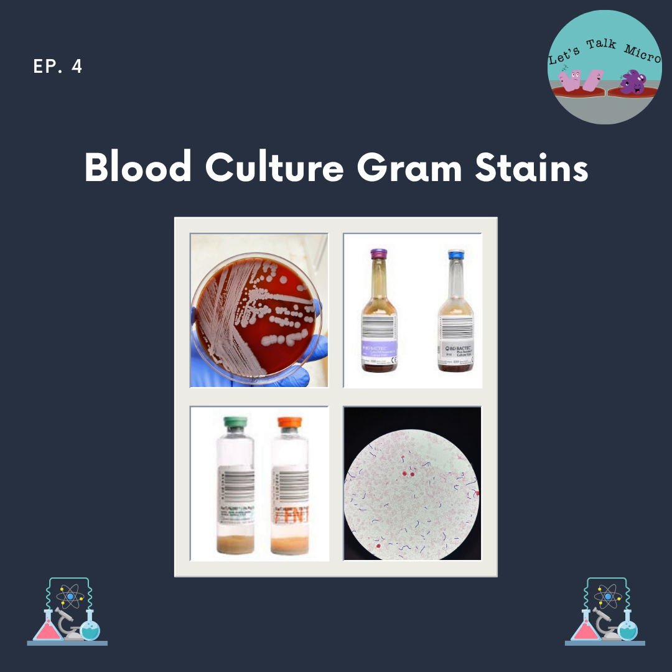And then these bottles are positive. What kind of media do we use? Well, regardless of if it's a true positive or if it's an NOS, and remember, you don't report an NOS, it's just documented internally. Your standard setup is blood, chocolate, and MacConkey for your aerobic bottle, and an anaerobic blood plate for your anaerobic blood culture bottle.